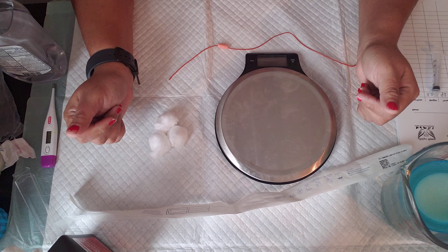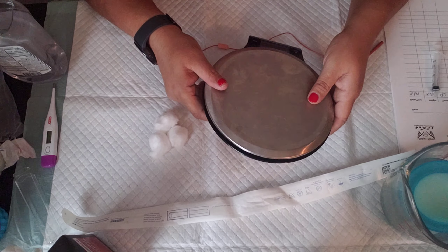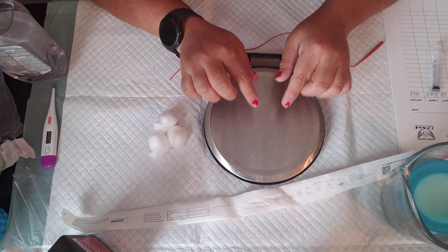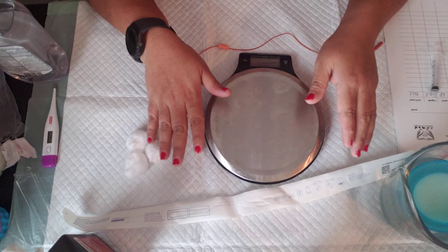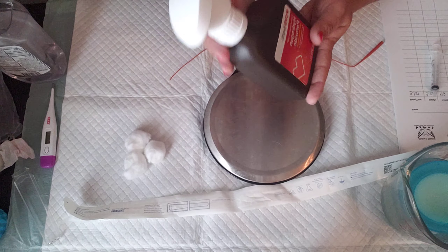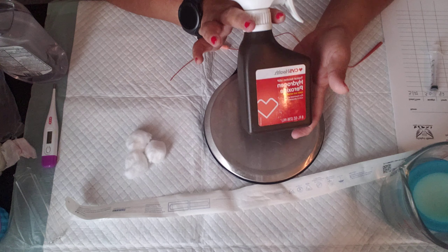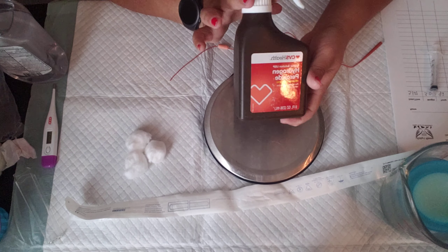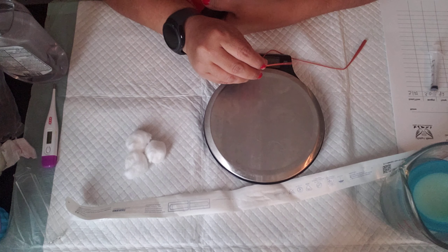You always want to take their weight so you know how much to feed them. You never want to try to feed a cold kitten — always try to get them warm first. That's the first step. Of course, lots of disinfecting. Keep your hands clean. Clean your supplies — not with peroxide, but maybe a mild soap and water.